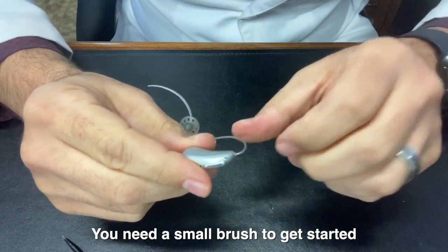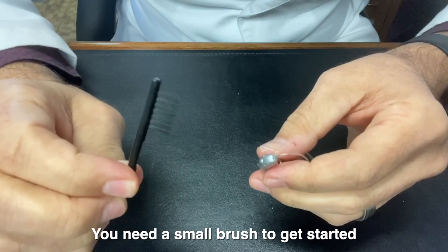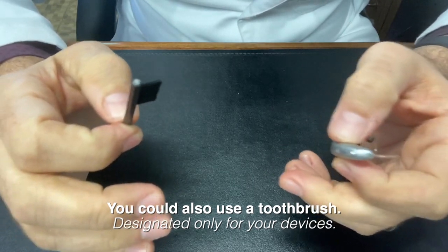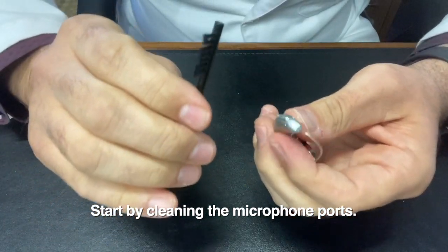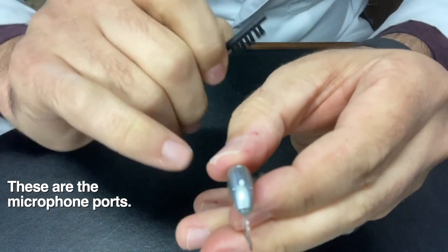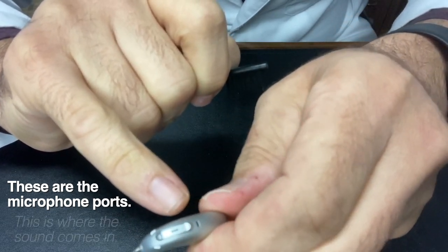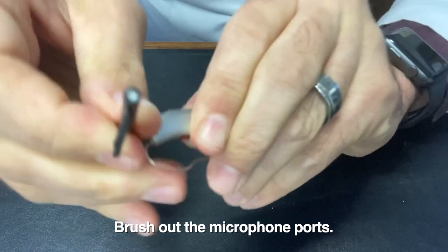The first thing I like to do is use a brush. If your devices came with a brush, you can use a little brush. If not, a toothbrush works just wonderfully if you purchase a toothbrush that you use only for your devices. I'm going to brush out the microphone ports. On this device, you can see there are these little holes — there's one there, there's one there, and then there's one on the spine of the device. I like to just go ahead and brush those out.